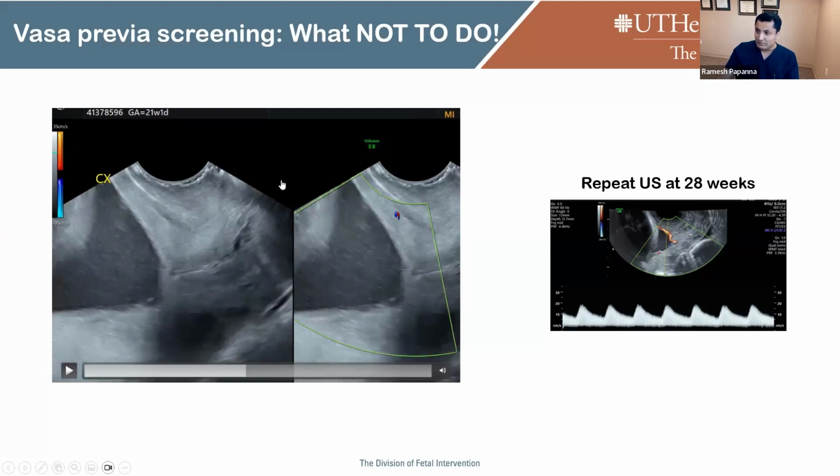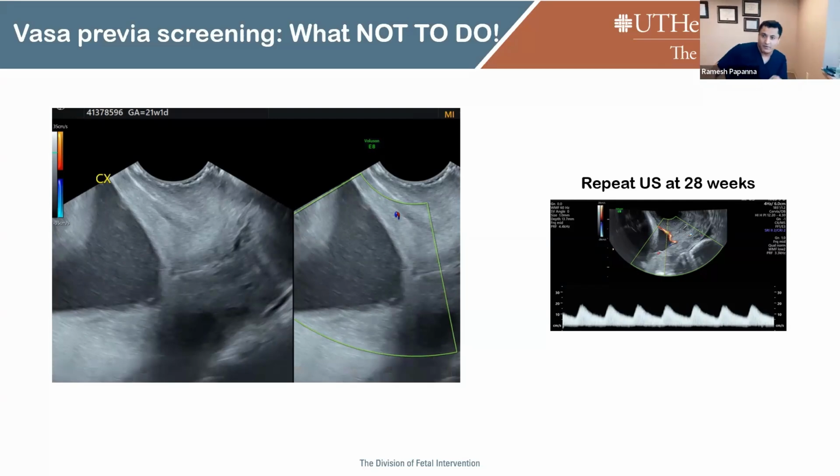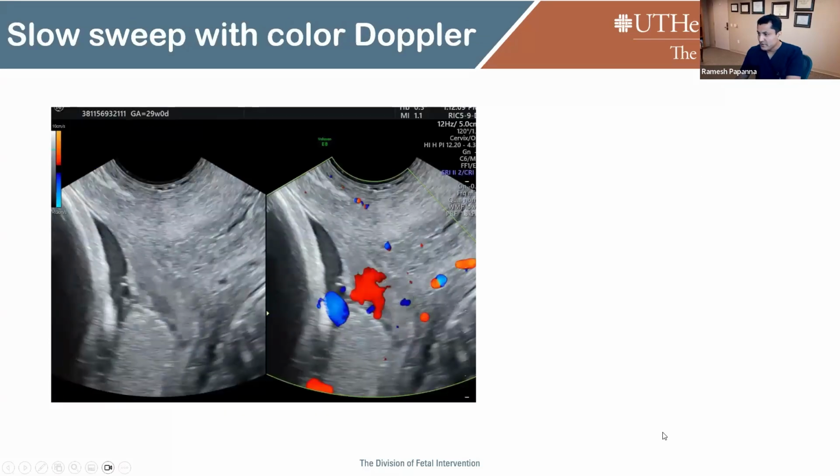The reason it was not picked up is because the PRF was kept very high, 35 centimeters per second, so you didn't have sensitivity in the Doppler to pick up a vessel. You really want to pay attention to the PRF when you're doing a transvaginal ultrasound, bring it down so that you can see the vessel light up, and then put a pulse wave on it. Those are the key things. Slow down, do a sweep side to side, know whether you're looking at an artery or a vein, and then get the pulse waveforms during that time.